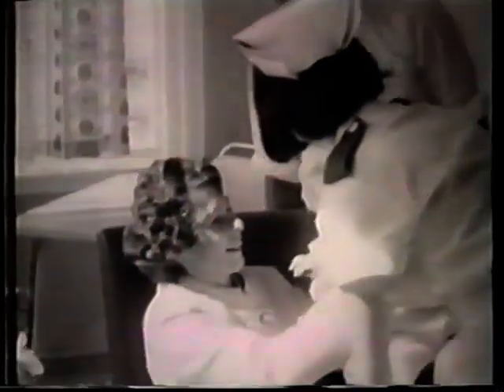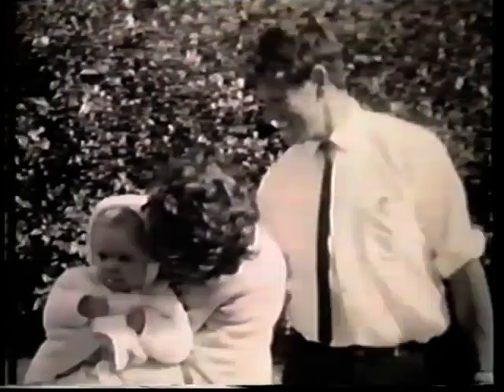Medical and nursing staff said she was a lucky baby to have her own mother on hand to feed and comfort her, and wished more mothers could do the same for their children in hospital. When Nicola's mother could feed and tend her and keep her happy, the nurses had more time to give to other small patients. Thanks to an ample supply of breast milk, Nicola suffered none of the setbacks that might have arisen because of her allergy to cow's milk.